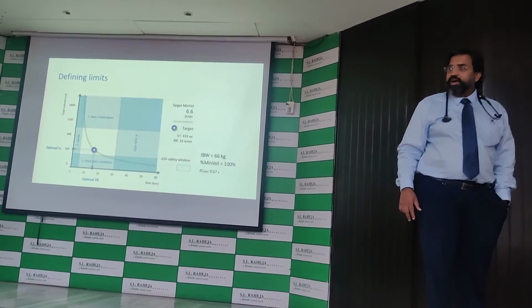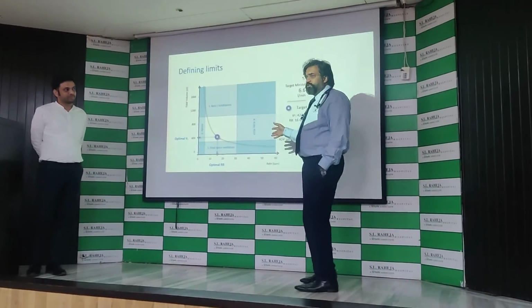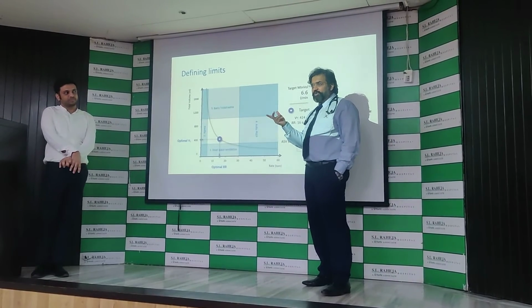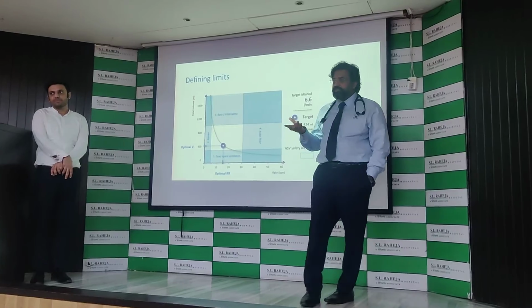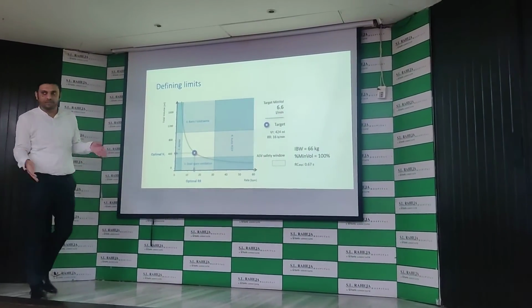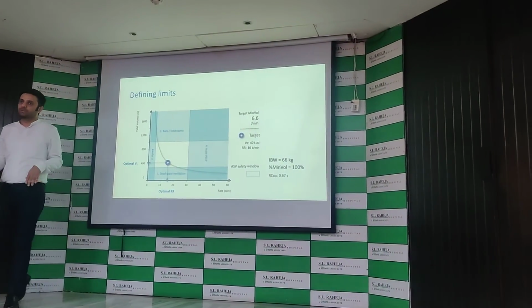Because what is going to happen is, as it is figuring out the compliance and resistance, it will change. The time constant will come to know. With that, it will understand that the auto-PEEP is changing, this is changing, that is changing. So it might change. If the compliance comes down and the patient is going more restrictive, the safety box will change to bring the target to less.